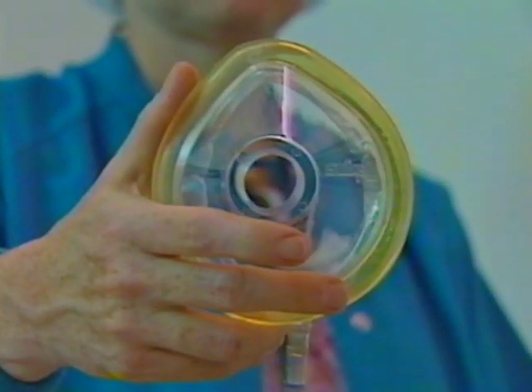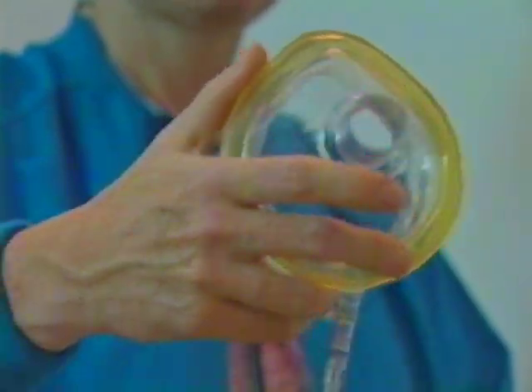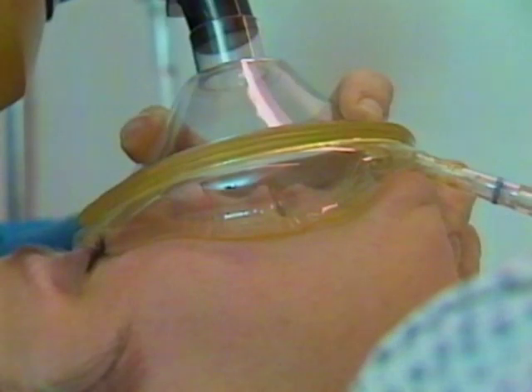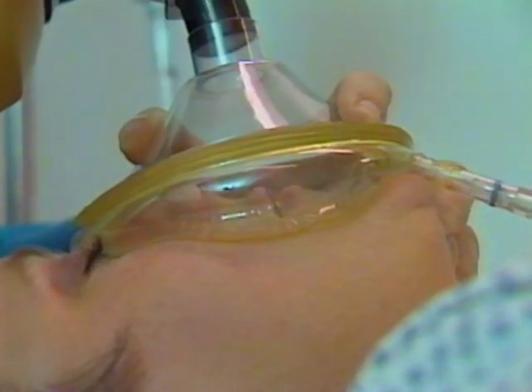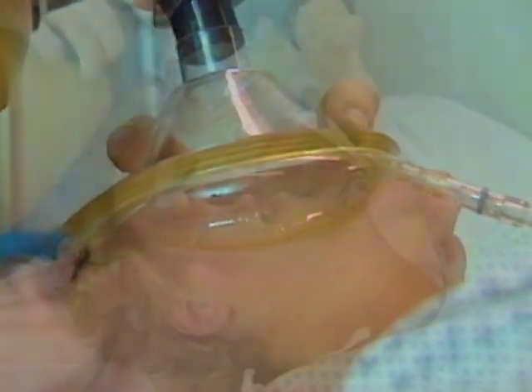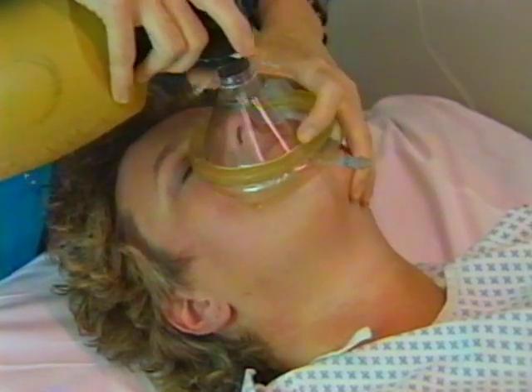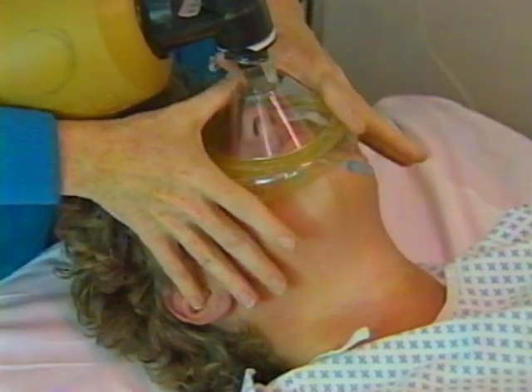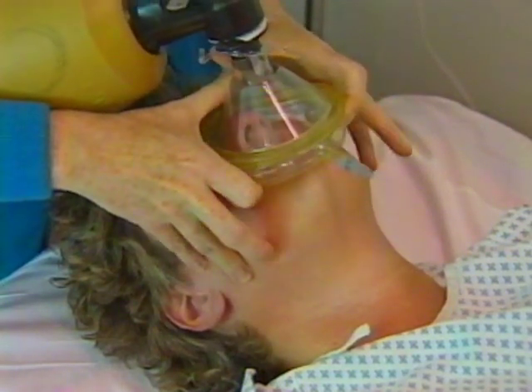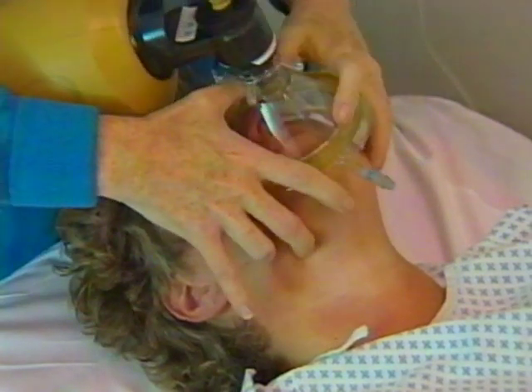Most masks have a rounded triangular shape. The apex of the triangle fits over the bridge of the nose and covers the space between the top of the nose and the crease in the chin. The entire upper and lower lips fit inside the mask. Lower the mask over the cheeks and allow the edges to grab the bunched cheek tissue. The bulk of the cheek now fills the gaps between the mask and the patient. Make sure the lower lip is inside the mask. Note the final position of the fingers.